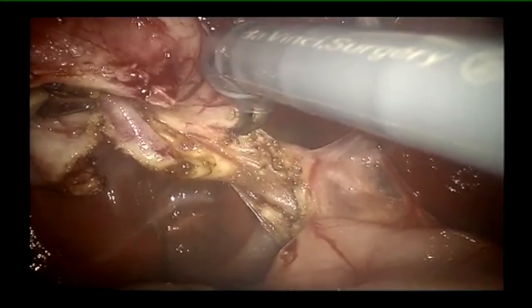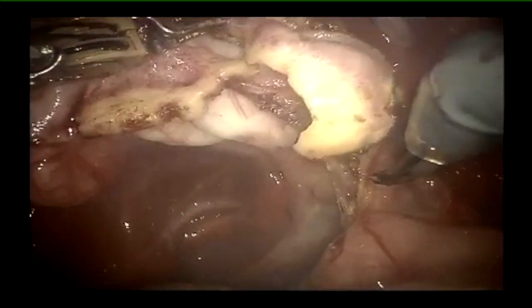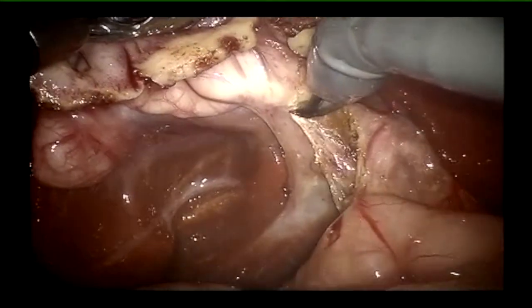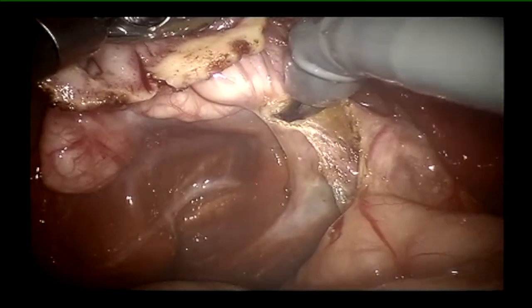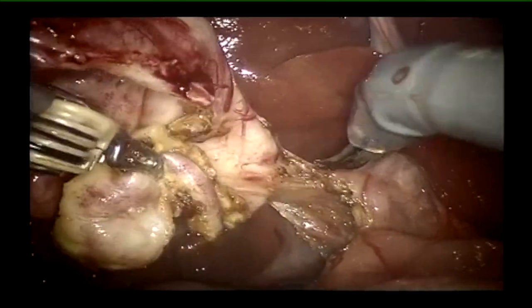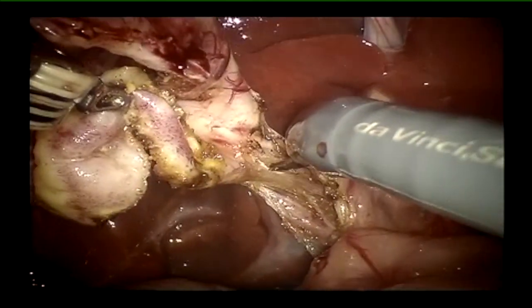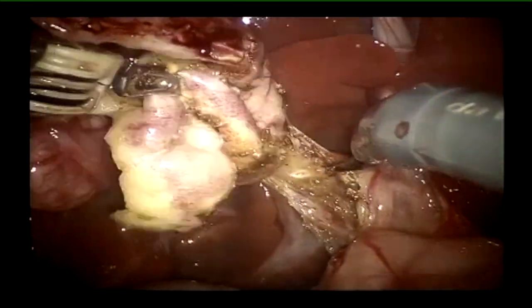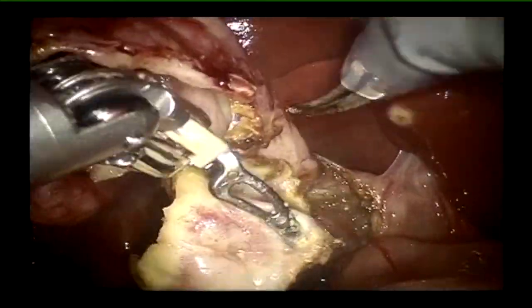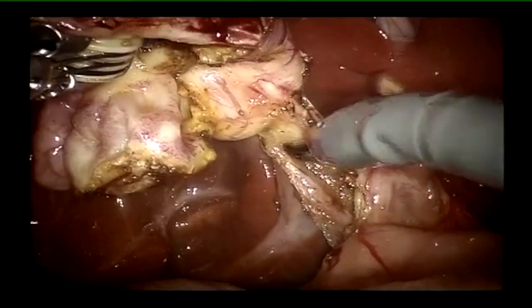As you gain confidence, you can go down in age and weight. We have now disconnected the cyst distally, and the proximal dissection becomes much easier. We proceed proximally until we can see the common hepatic duct — which is usually not involved in this type of choledochal cyst — and as you can see, there is a very distinct narrowing and return to normal anatomy as we approach the common hepatic duct.